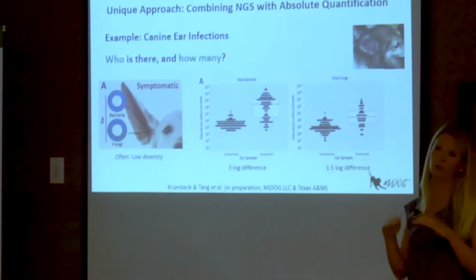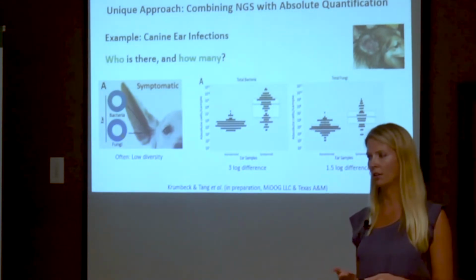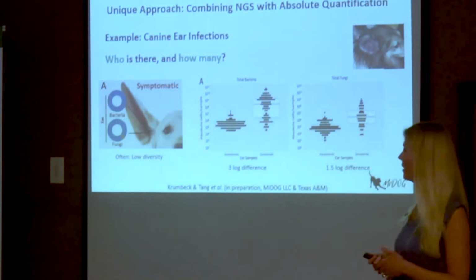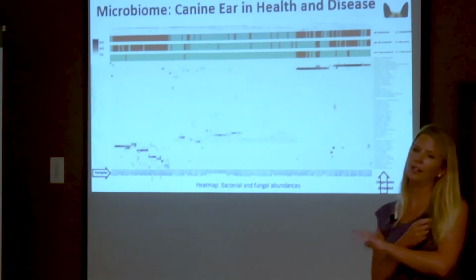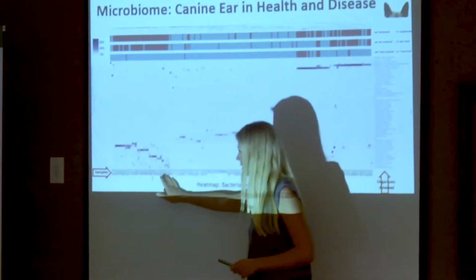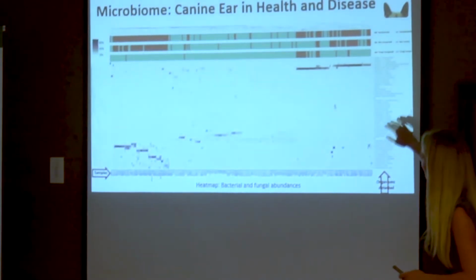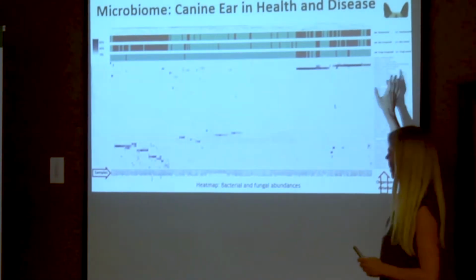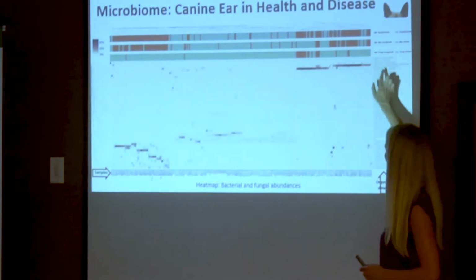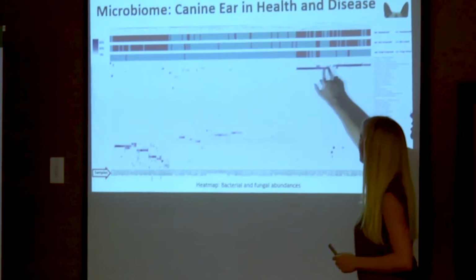So just by the amount of different organisms you find, you can already have a pretty good idea: am I dealing with a dog that's healthy, or am I dealing with a dog that's subclinical or already infected? And we did that for hundreds of dogs. And down here, we list all the dogs that we were looking at, and up here, the top organisms that we find. And every time you find an organism, you give a color. So the more often you find these different organisms in a sample, the darker it will become, and the more abundant they are, the darker the spots.